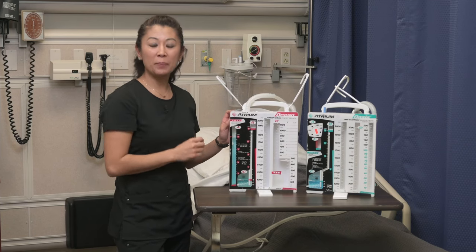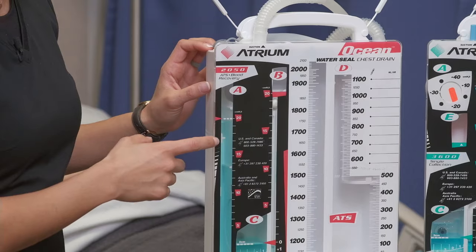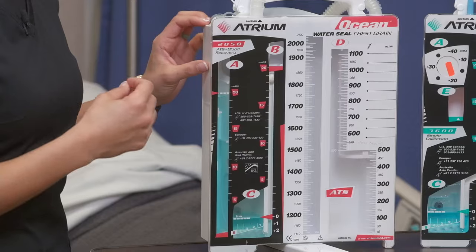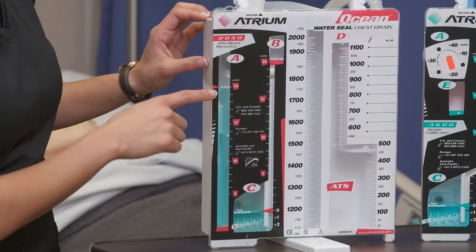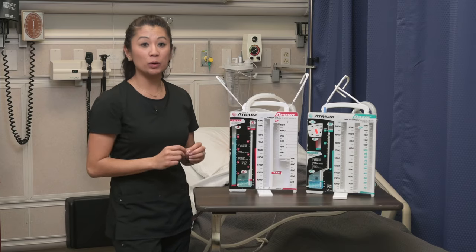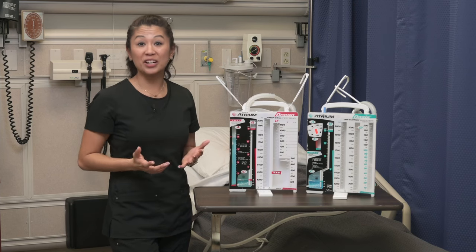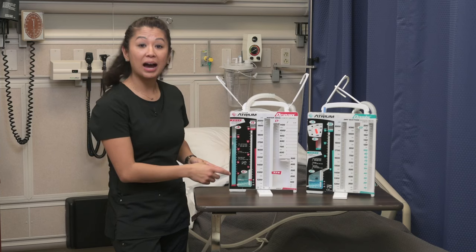Here's where we differ from dry to wet — think water, think wet. For wet suction, we look at chamber A. The height of the water is at negative 20, as shown on the dotted line. Negative 20 is a very common suction setting, and the height of the water is what controls the suction.